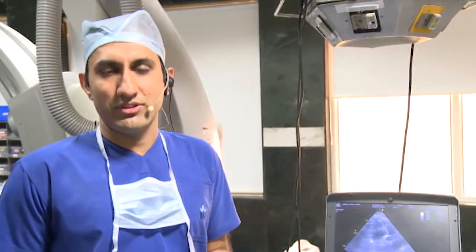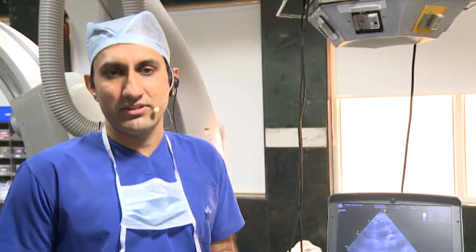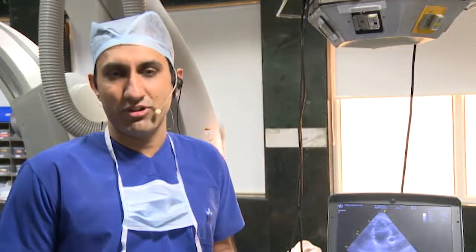It actually came out and there was some hematoma going on. We deployed our ProGlides immediately once the valve was deployed. However, still there was some bleeding. So we went from the right side, did a balloon tamponade, and the vascular surgeon has opened up the groin and they are repairing the common femoral artery surgically.